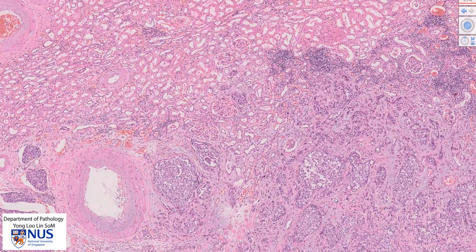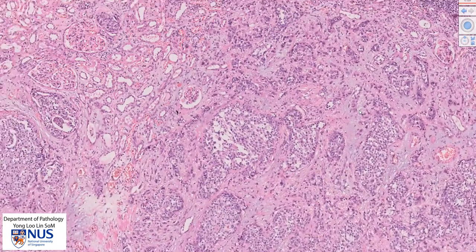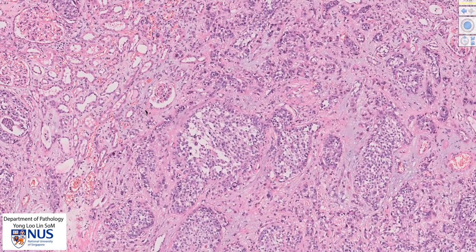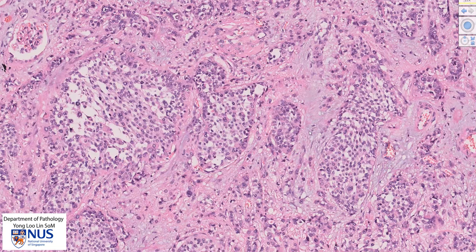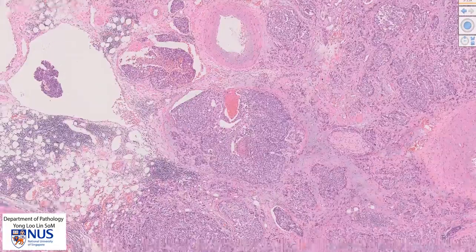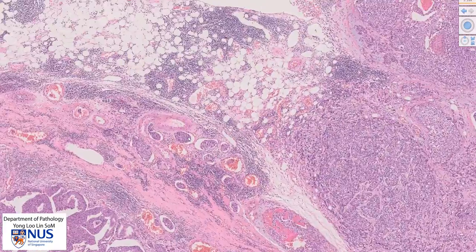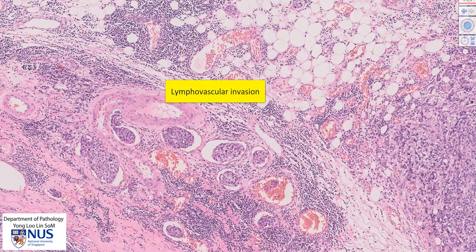So this tumor has clearly invaded beyond the renal pelvis into the renal parenchyma. And in this region, we can see lots of these irregular sheets of malignant urothelial cells invading into the renal parenchyma. These sheets are surrounded by desmoplastic, very disturbed-looking stroma. This case also shows another interesting feature: over here, we can see these little nests of tumor cells sitting within vascular spaces, so there is lymphovascular invasion as well of this tumor.